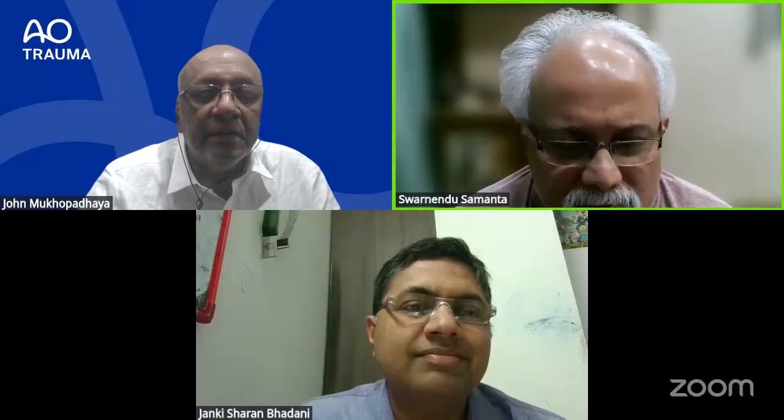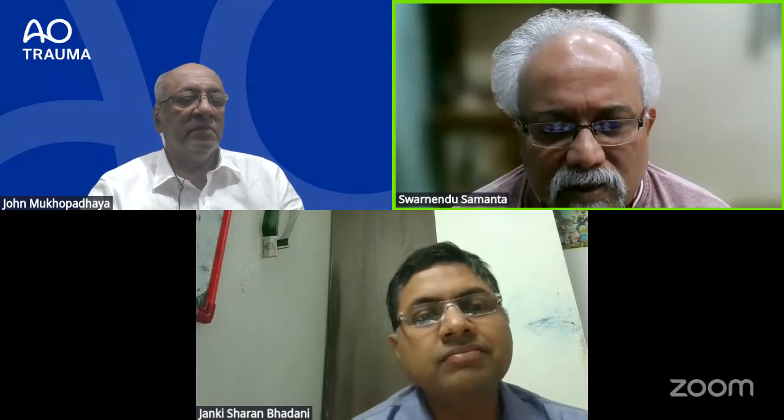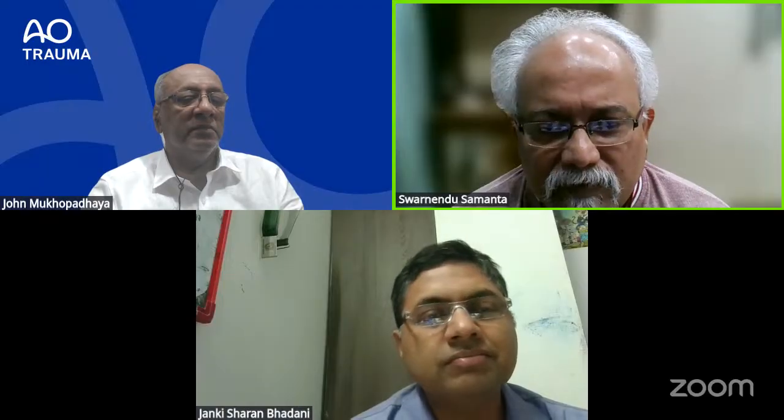Okay, I think, John sir, with the way we have traveled through reading the radiology, if they follow this, the great words from John sir, the examiner is not expecting every time, even mostly in the tumor situation also, most of the time you won't be able to diagnose unless it is a clear-cut tumor. But you have to follow, in the next tumor class I will tell you how to read from the inside to out or outside to in.